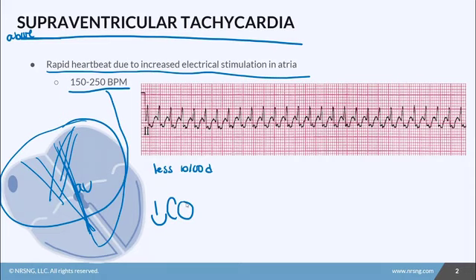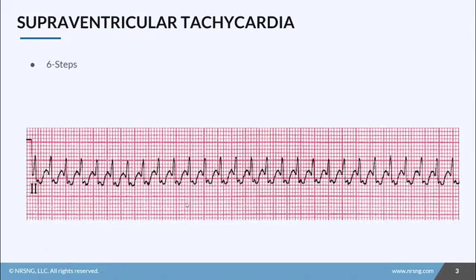Let's look at the characteristics of SVT and break it down using the six-step method. Step number one, let's look at the rhythm — do we have a regular rhythm or an irregular rhythm? So let's count some boxes. From here to here we have six boxes, from that one to that one we have six as well, and from there to there we have about six. So our rhythm is a regular rhythm.